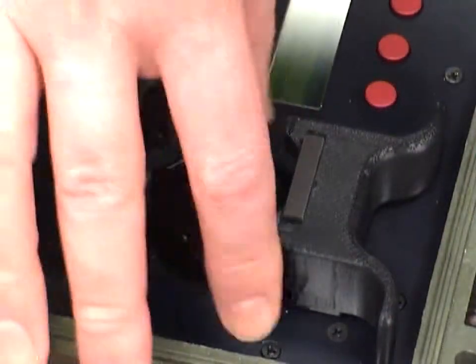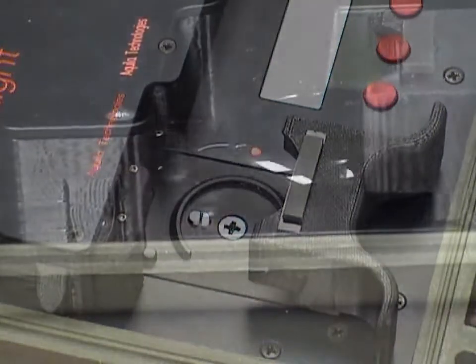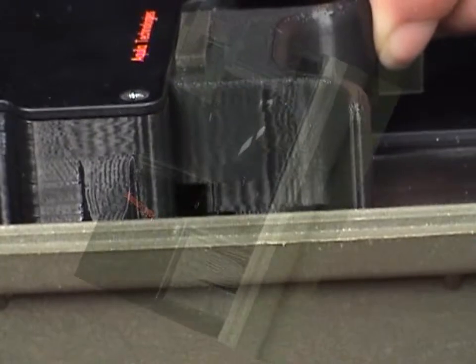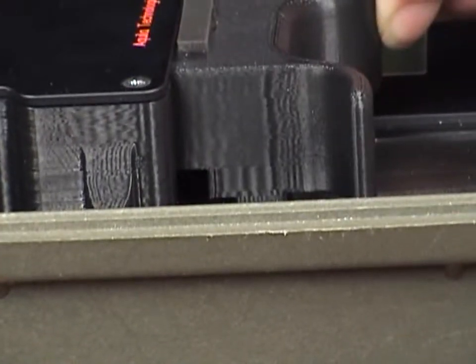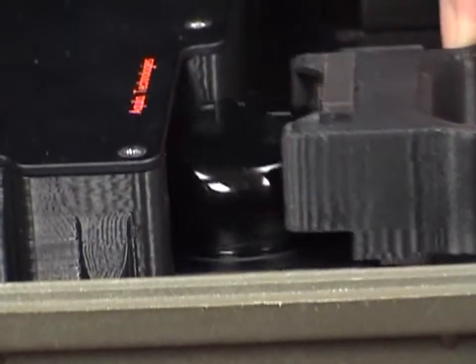Remove the dosimeter by pulling the drawer out and turning the dosimeter in the opposite direction of the arrow. As the drawer is pushed into the reader, the cap is raised up off of the RadWatch base. This allows the reader to pull the RadWatch sensors into the optical engine for analysis. Pulling the drawer out returns the cap back onto the base.